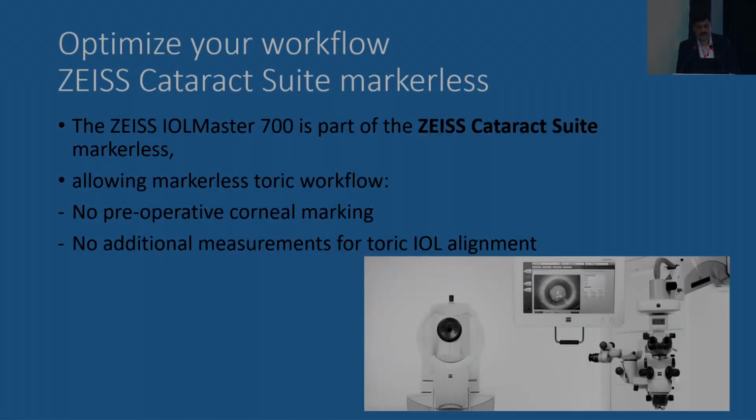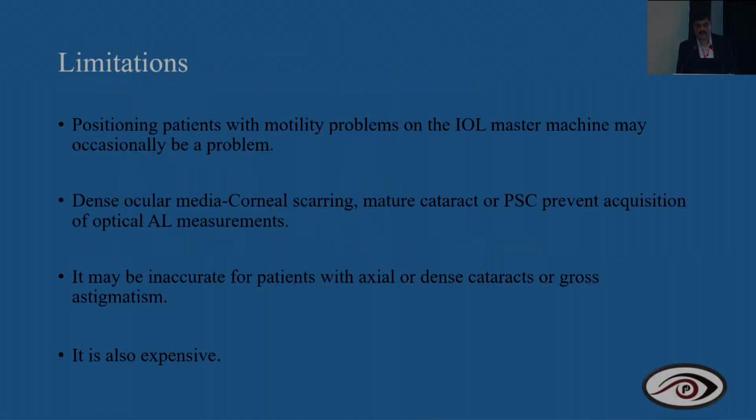So we can integrate it. I do a lot of torics and toric multifocals, so it integrates with the Zeiss Cataract Suite. So no preoperative corneal marking is required, and no additional measurement of the toric IOL alignment.